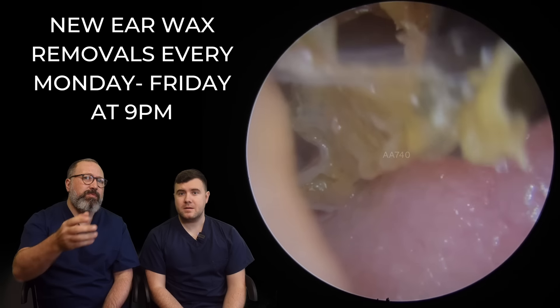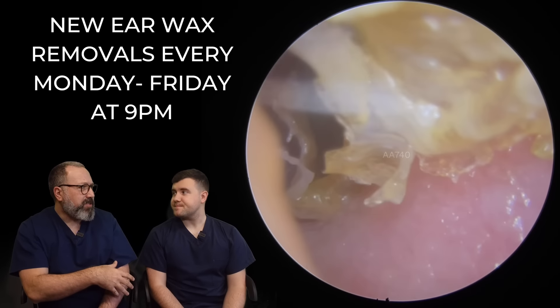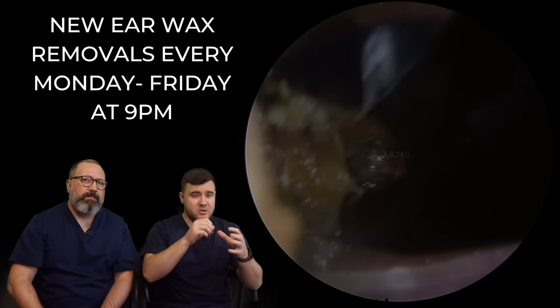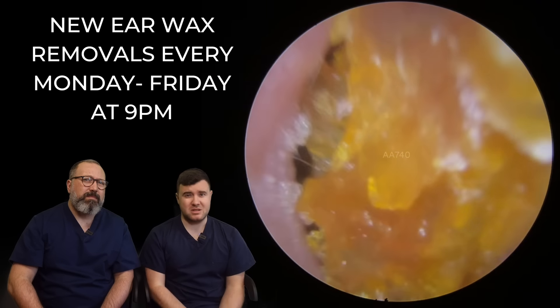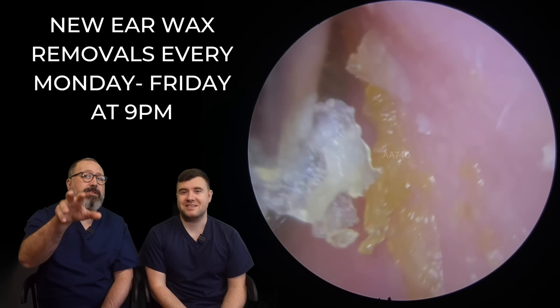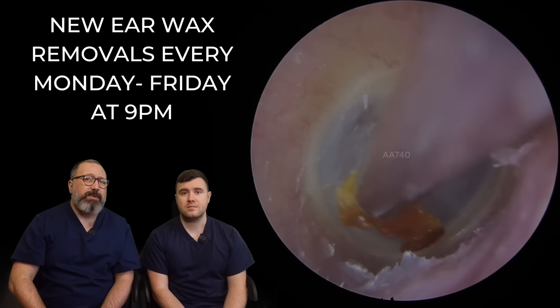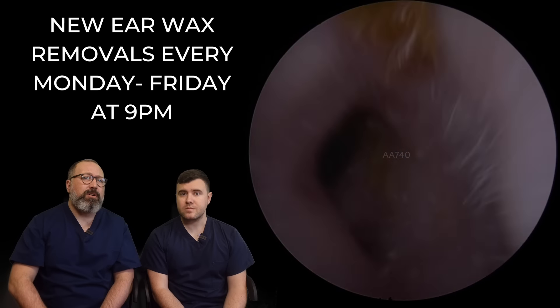Now, we were talking about the fine jaw forceps — this type of skin can sometimes be its nemesis really; it's not as easy to pull through. It tears through the center sometimes. The wider jaw forceps would be a bit easier for this type of skin, but I don't personally like using them. The vision is not as good. And especially when you've got this layered canal, the entrance is quite narrow, so it's a little bit more difficult, especially when you're using a wider jaw forcep because you're going to block your view. But it's looking a lot clearer in there.